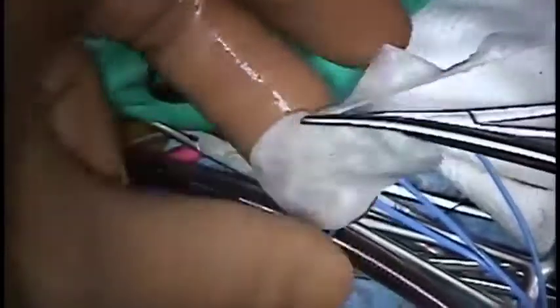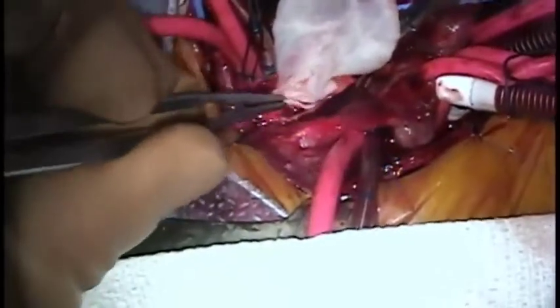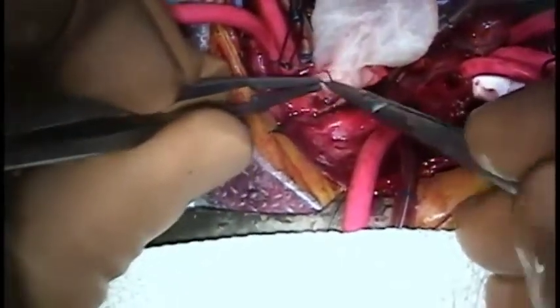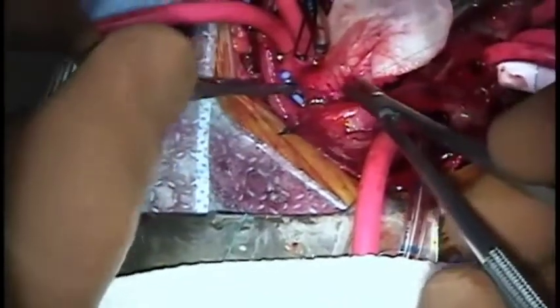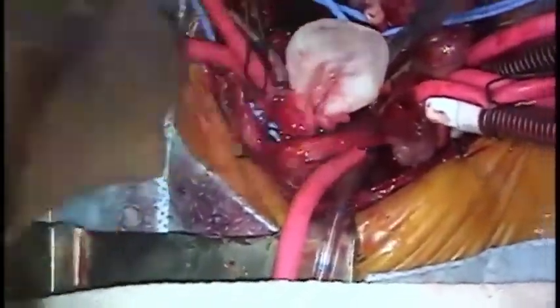Pulmonary homograft patch would also be a suitable material for the aortic arch reconstruction, but often calcifies in the long term. The patch is sewn in, starting distally. All of the suture lines are made using a 7-0 Prolene with a BV black needle. Having the same diameter of suture is important for knot security as each suture is tied as the anastomoses intersect.